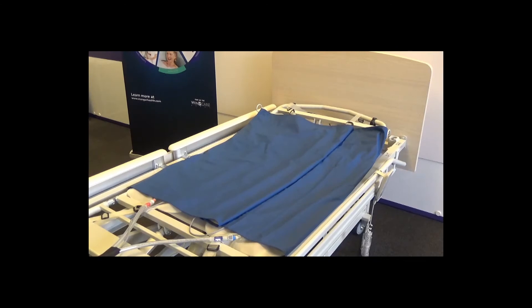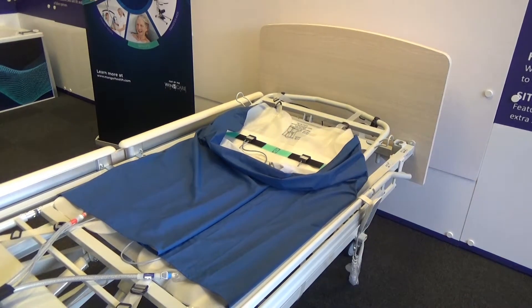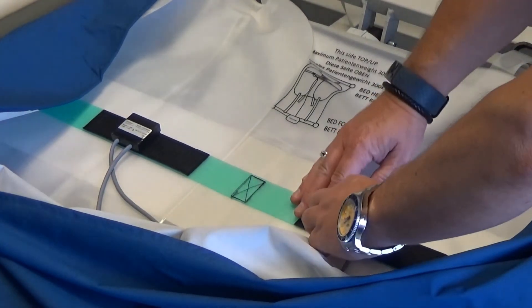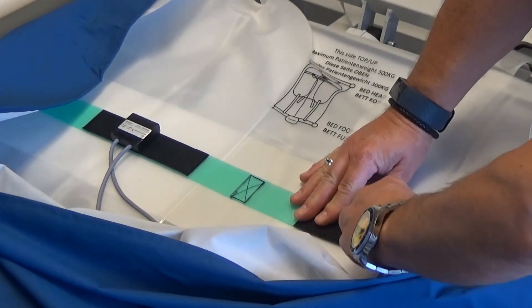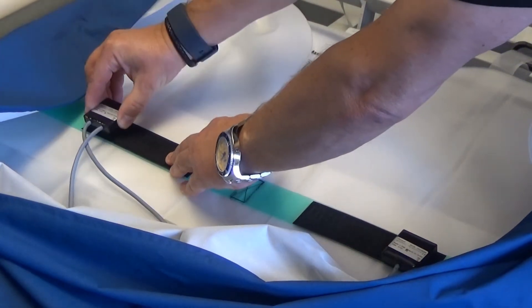Position the Ecomove air chamber system and protective blue cover centrally on the base of the bed. Check the sensors are lying completely flat. There are two sensors which can be detached and repositioned depending on the width of the patient — moved out for wider patients and closer together for slimmer patients.